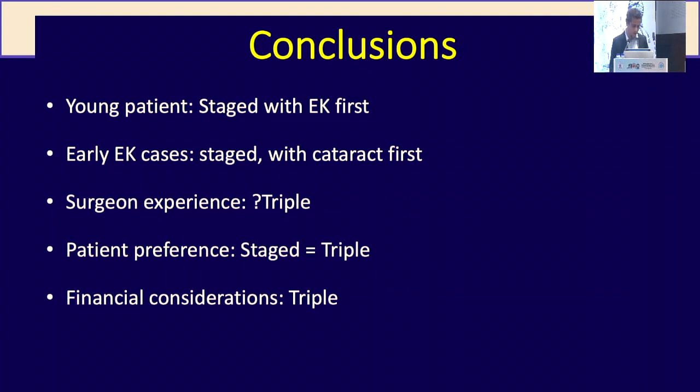So just to conclude, I hope these are the conclusions. Young patients, you can do staged with EK first. We have early EK cases. You can use those parameters on Pentacam. You can do staged with cataract first. Surgeon experience, well, it depends.